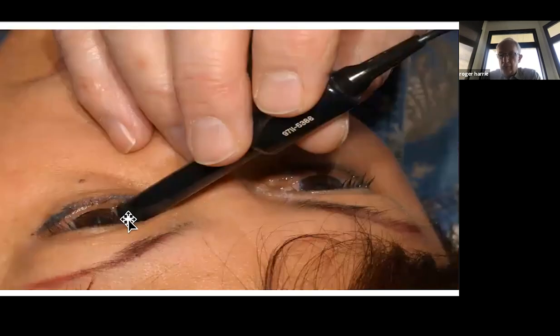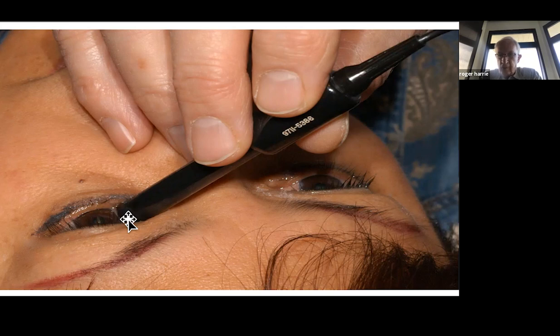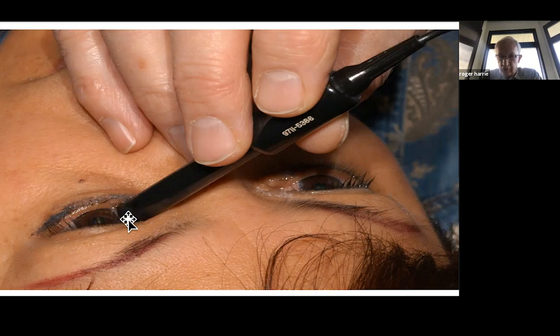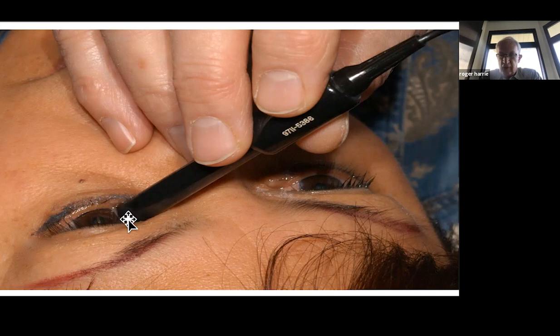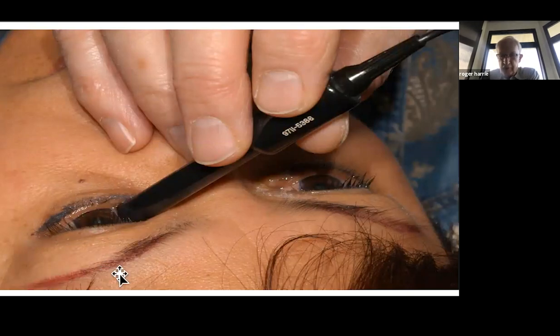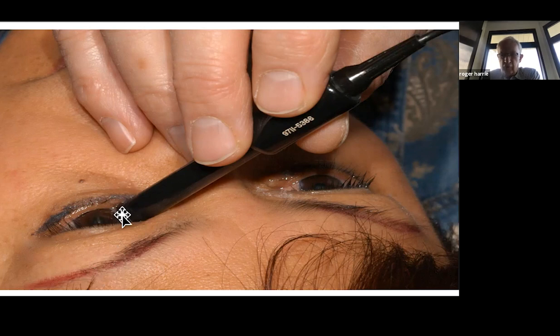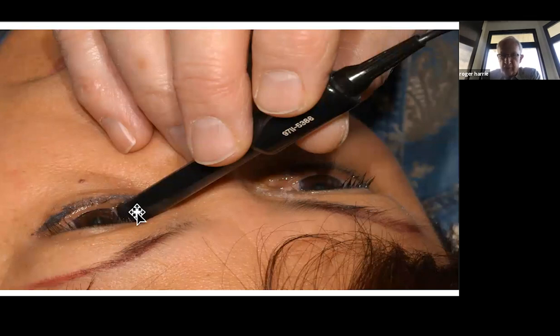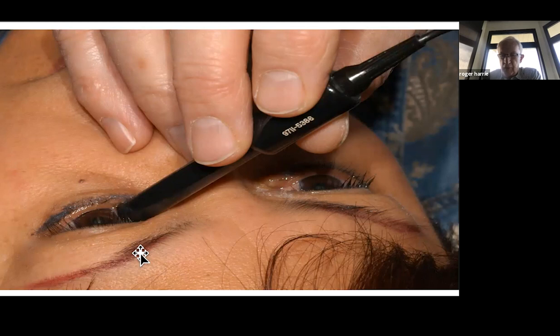The A-scan probe has no marker because it has no internal oscillating transducer. The A-scan simply generates a sound wave that travels straight out — it doesn't rotate or sweep back and forth like the B-scan. The A-scan probe is therefore thinner. Its tip still uses the same piezoelectric crystal principle — stimulated by electrical pulses — but it is stationary.